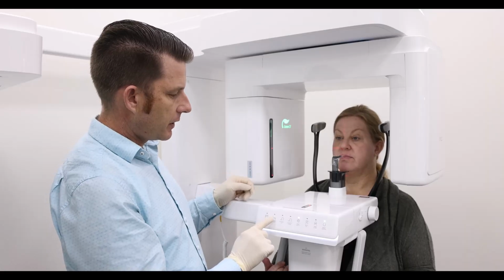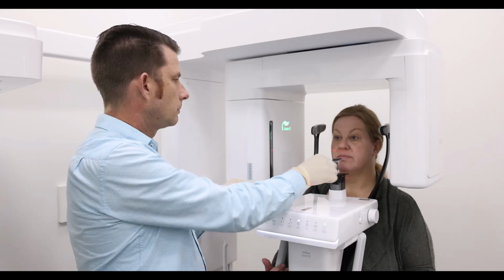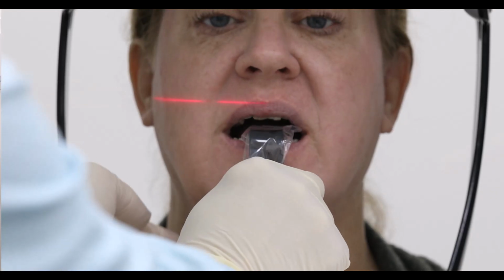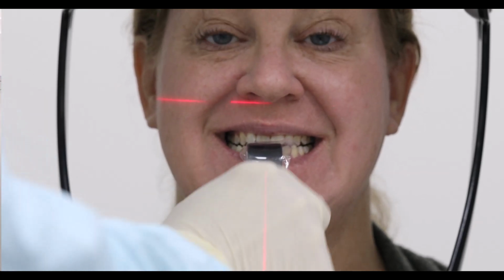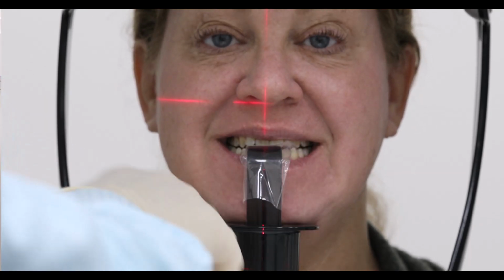In this case, I need to bring the column down a little bit. You go ahead and open and bite on the bite stick. Smile really big. I can see the patient's biting in the bite stick groove. I'm going to push down on the bite stick to ensure the chin is on the chin rest.